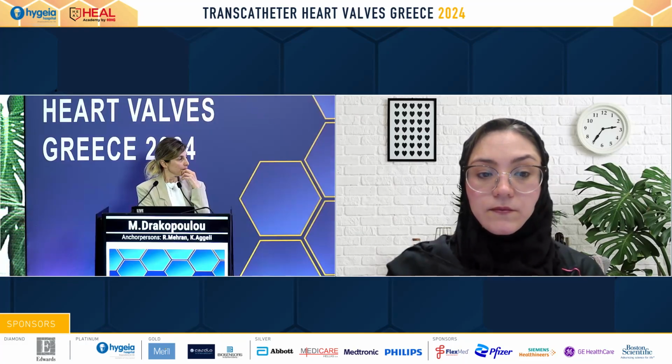Yeah, that's a good comment. I also wanted to add from congenital patients that in our everyday practice, the subcostal views sometimes give us a very good idea of the tricuspid valve anatomy. Not all adults obviously have clear subcostal views, but as you are there looking at the IVC and what it is doing on inspiration, if you do the subcostal short axis, you will get a view like the transgastric view that you showed very beautifully.